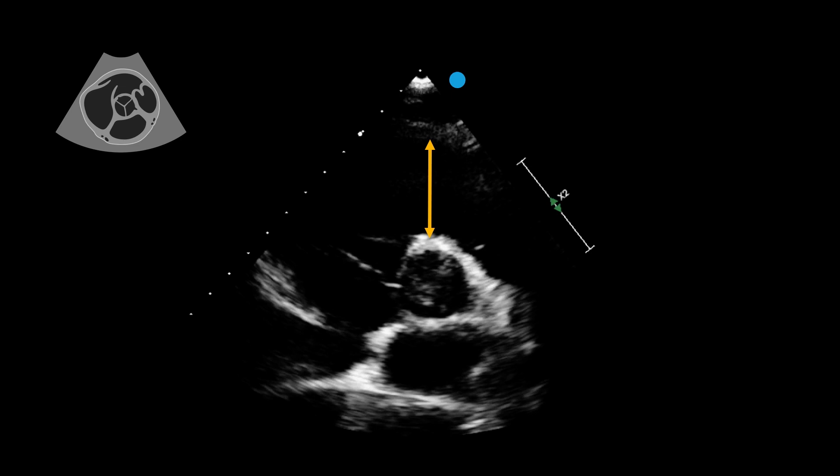The distal RVOT can be found just above the pulmonary valve. Similarly, it can be measured by placing the echocursor just outside the aorta, this time above the pulmonary valve at about two o'clock, stretching to the endocardium.